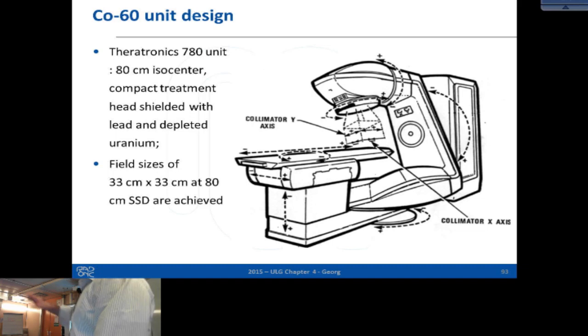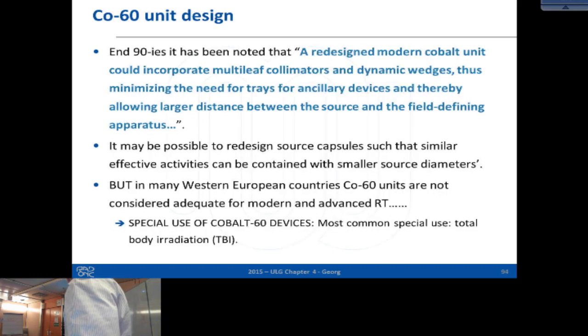I mean, the isocenter principle, like from an accelerator, the same holds for a cobalt unit. Cobalt units also had one peculiar characteristic in some units, where you could spare some concrete for the shielding of the primary beam. They had something called a beam stopper, which first of all provides a counterweight to the treatment head, which is then a bit simpler for the mechanical balance of the whole machine. And if you load this also with lead, you can get a kind of attenuation of the beam, and that can reduce the costs for a treatment room in terms of shielding. This beam stopper was also something specific for cobalt units. It was used in some centers.